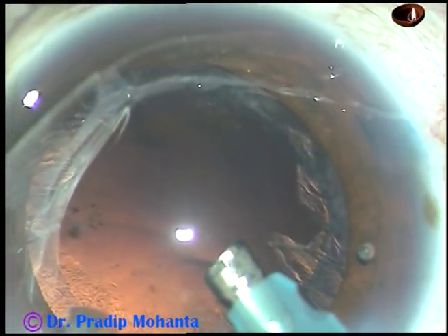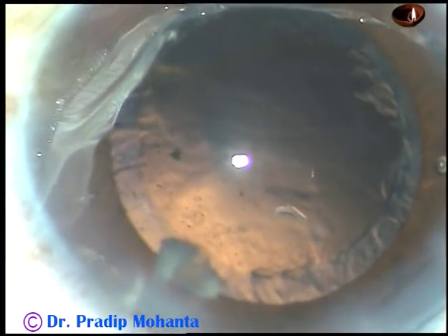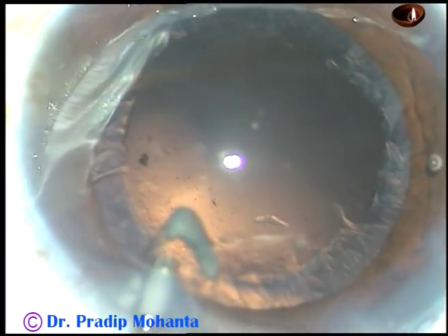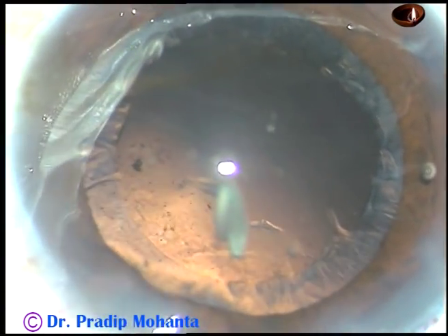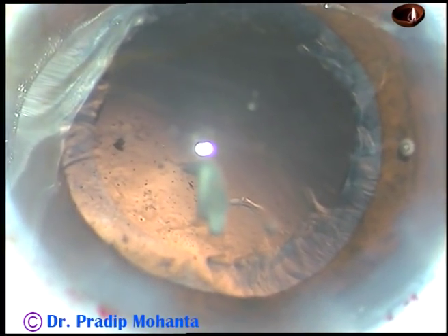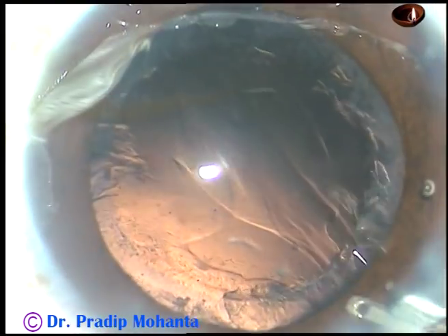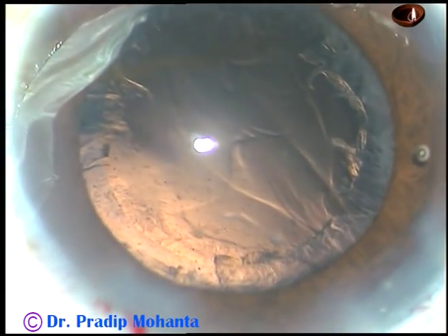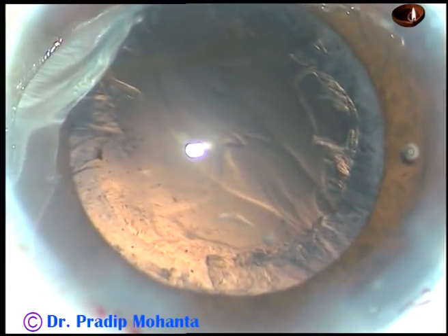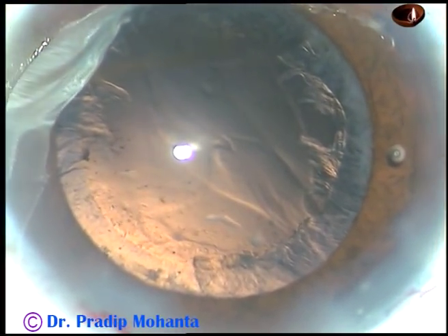I could not remove this small bit of nucleus. So I come out, inject some viscoelastic substance, take a Simcoe cannula, go underneath this fragment, and scoot it out through the main incision. Sometimes it is safer to remove small bits of nucleus through the main incision without using any ultrasonic energy.